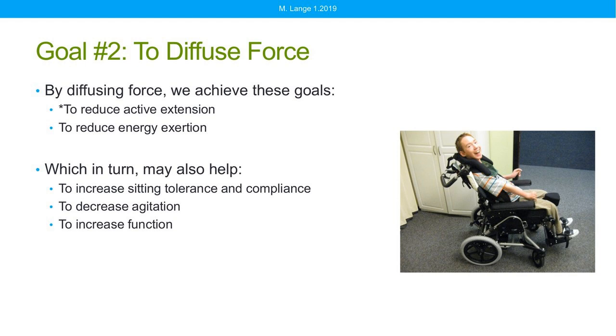You know, I work with a lot of clients like Daniel, who's pictured here, who look like they're just fighting their system all day long, and they burn a tremendous amount of calories. Gaining weight is the issue. It's certainly never losing weight. By diffusing some of those forces, we can reduce that energy exertion. I've actually seen some clients who have gained some weight after having dynamic seating, and typically much needed weight.